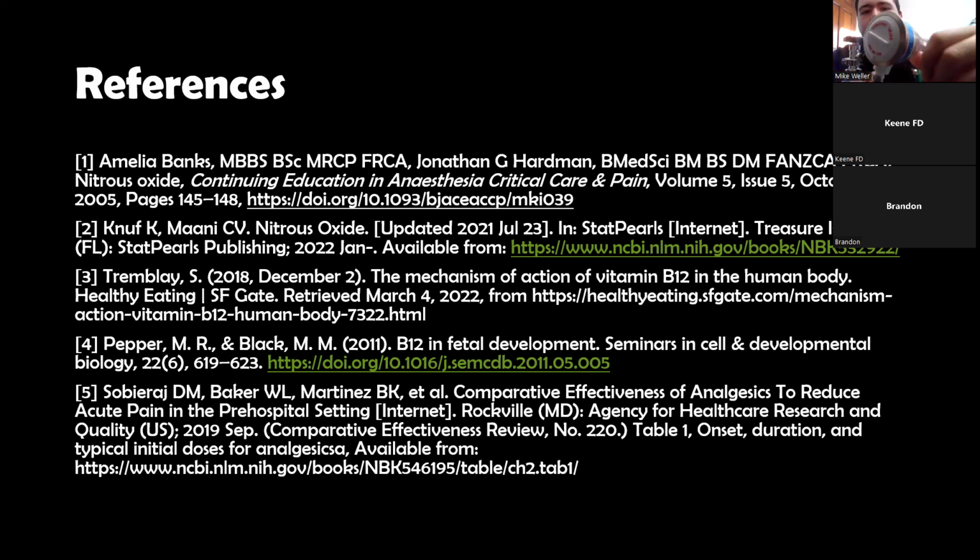And then this hose goes to a demand valve. Now, you can't do anything with this demand valve, okay? Your mouthpiece or your CPAP mask is going to go right on the end there. And then it's only going to deliver gas when your patient inhales. So they have to forcefully inhale enough to trigger that demand valve and pull air in.